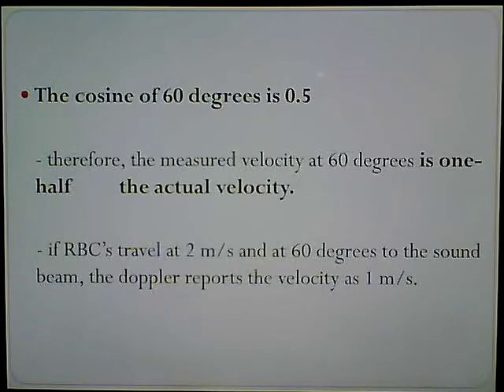And that's okay, because that's the basis of all diagnostic studies. That starting point is dropped down to half of what the actual velocity is. Medicine is based on it as far as ultrasound. So all they did was drop the starting point. It's not like, why are we only half right? We're not. The foundation of Doppler is based upon being half right, and every other number is knocked down from there.